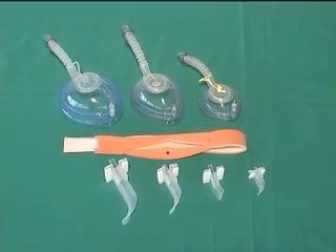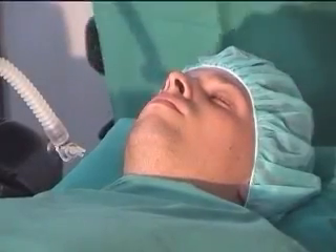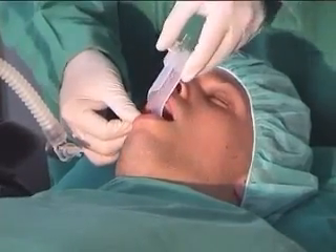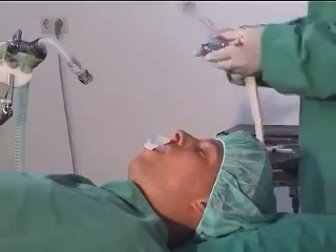Three sizes of endoscopy masks and bronchoscope airways are available. The VBM Bronchoscope Airway has a large lumen, while the rigid bite block protects the expensive bronchoscope.